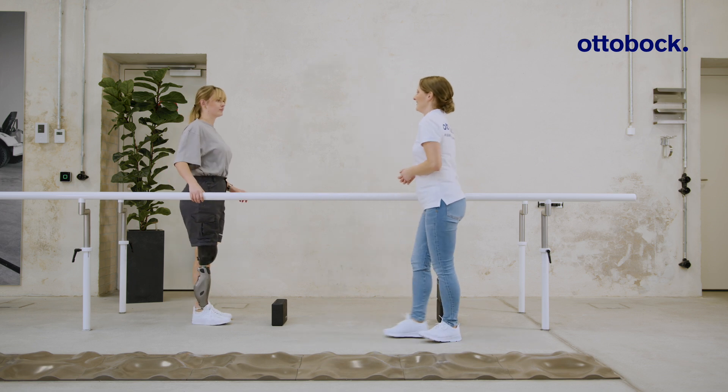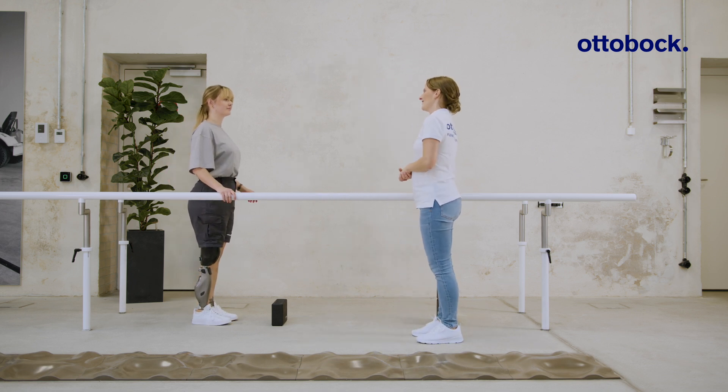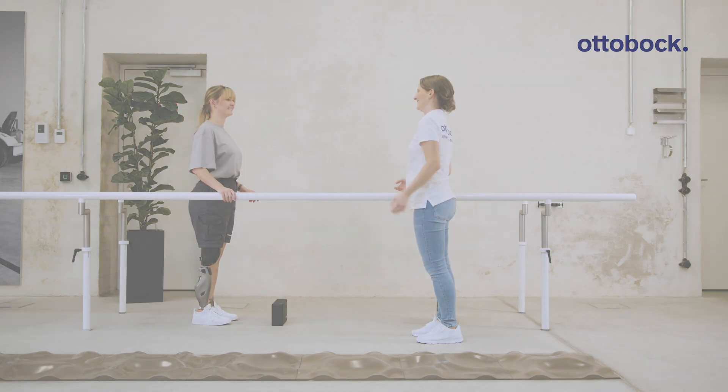Finally, practice the function outdoors.